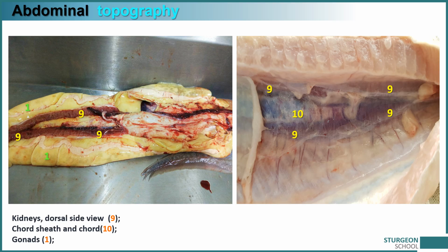And the last thing we can see in the diagnosis is the chordal sheath, number 10 in the photo.